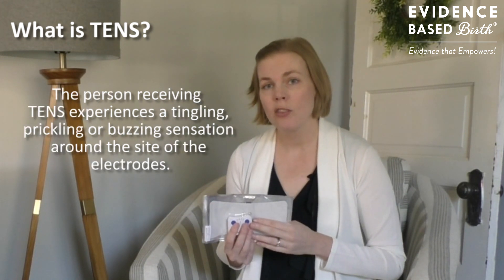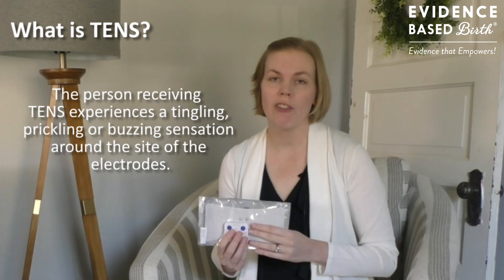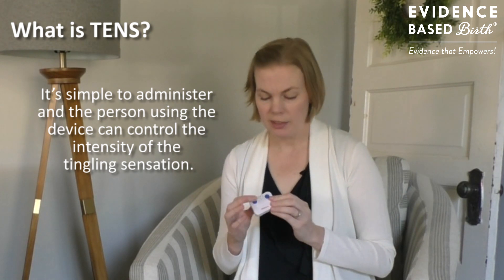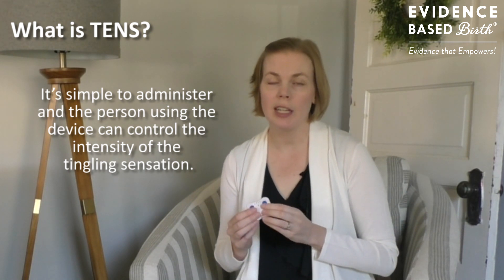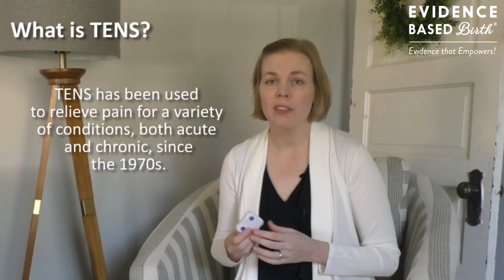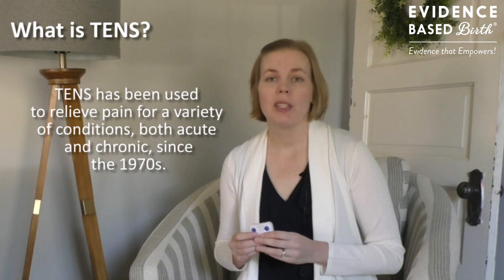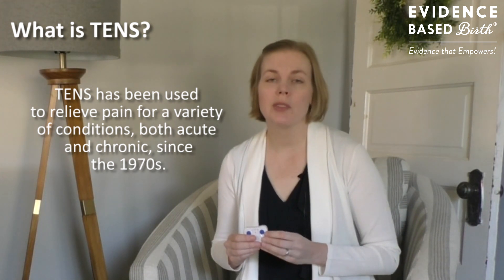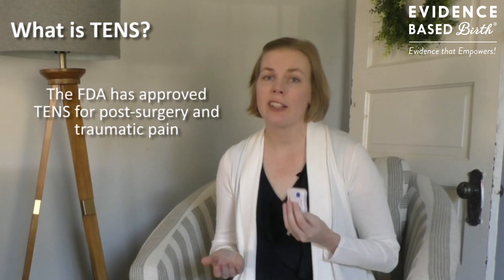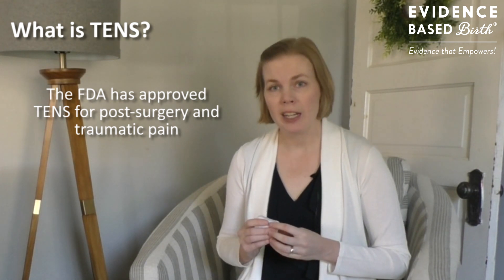When you're using TENS you might feel a buzzing, tingling, or prickling sensation wherever the pads are placed. It's easy to administer and the person receiving the TENS can control the intensity using the buttons on the device. TENS units have been used to relieve pain for a variety of conditions since the 1970s, including menstrual cramps, arthritis, and several other chronic pain conditions. The FDA has actually approved TENS for use post-surgery and for traumatic pain.